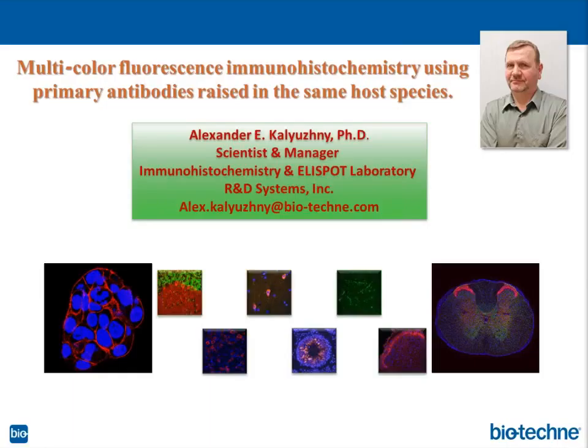If it's an abundant antigen, then you can take 30 minutes or 1 hour, but if not, you go for 2 hours. But again, I assume you have a control with no primary antibodies where you add just secondary antibodies and compare side by side to make sure there's no non-specific sorption of secondary antibodies which imitates or mimics the specific signal.